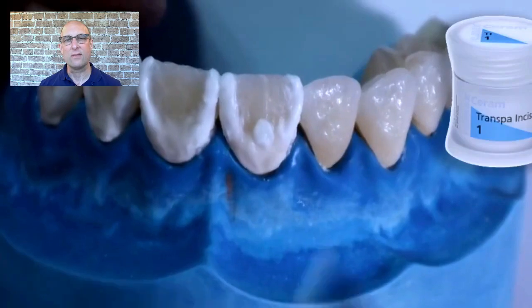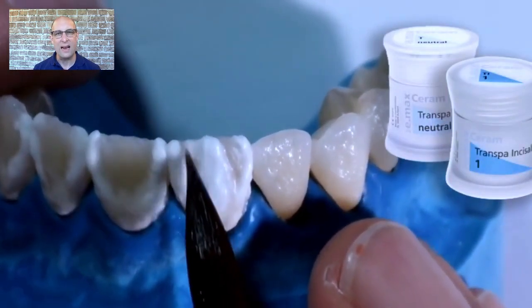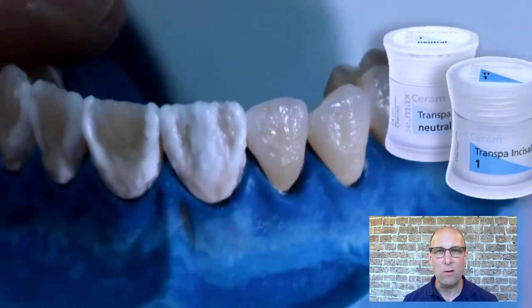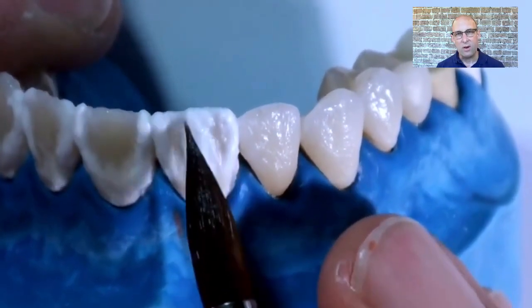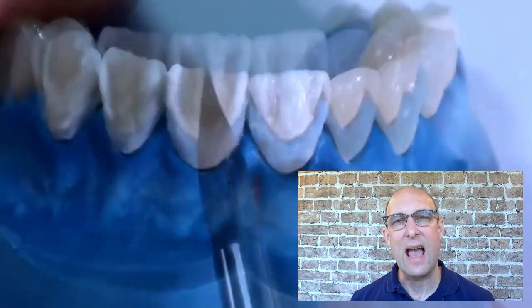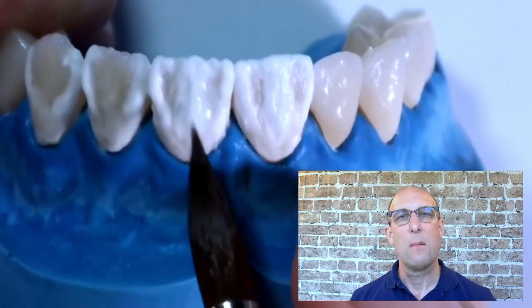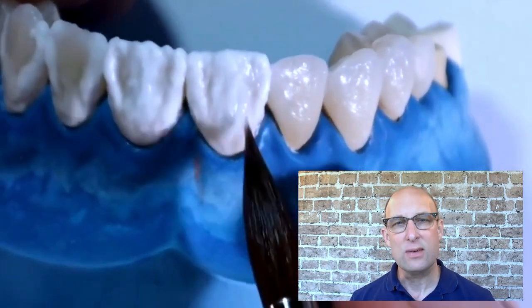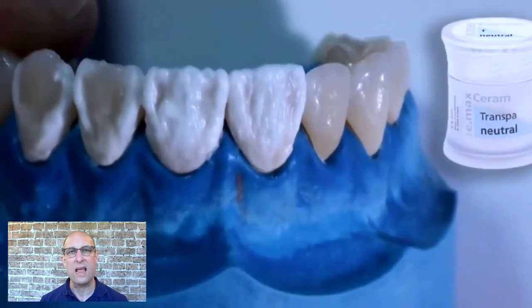I use Translucent Incisal 1 and apply it in the center of the crown along the long axis at the incisal edge, spreading the TI1 slightly out to implement a kind of filter. If you want to increase translucency, you could use Neutral at the incisal edge instead, or add a little Cervical Translucency to create the orange-looking effect you sometimes see in the incisal. I then spread the middle parts of the TI1 toward the mesial and distal. All these porcelains placed during the second bake act like a filter to block light — more translucent material makes the crown more translucent; more opaque or milky porcelain makes it less translucent, so you can control the final value. After that I fill up the rest of the crown with a thin layer of Neutral.